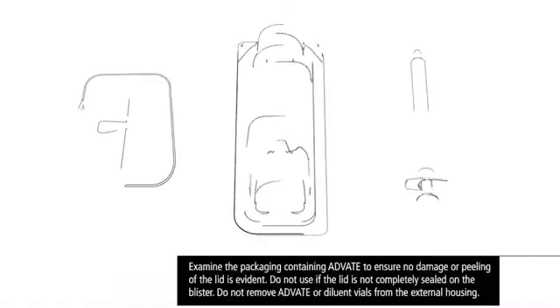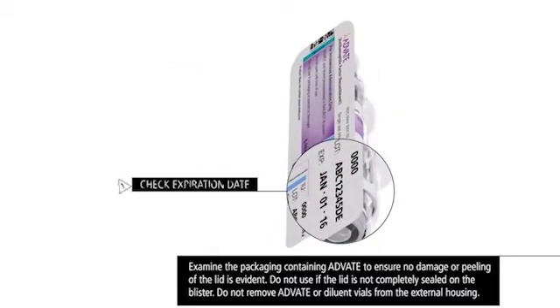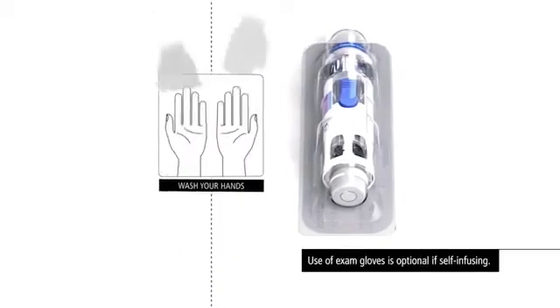Place your infusion materials on a clean, flat surface. Check the expiration date and verify the correct potency to be infused. Allow ADVATE to warm to room temperature. Wash your hands. Use of exam gloves is optional if infusing yourself at home.